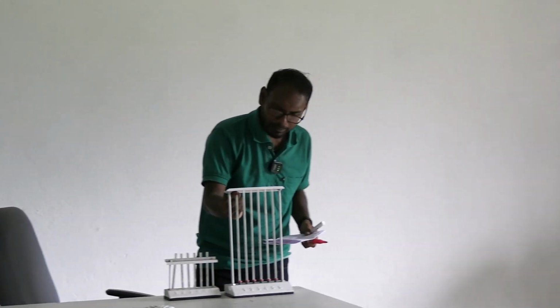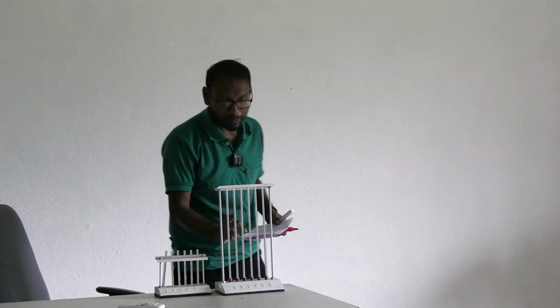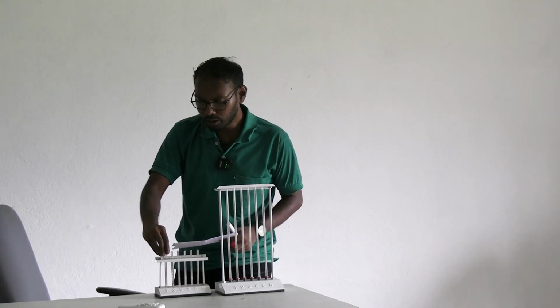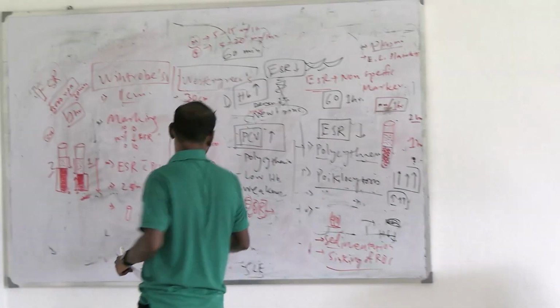This is the upper part is also open and lower part is also open, but if we keep the lower part open, the blood will spill out. So we use actually corks, okay, to close that end. So দেখো এই যে প্রত্যেকটা নিচে cork রাখা আছে. There are rubber corks to actually close that end, so that the blood doesn't spill out while it is sedimented. So both ends open, okay.